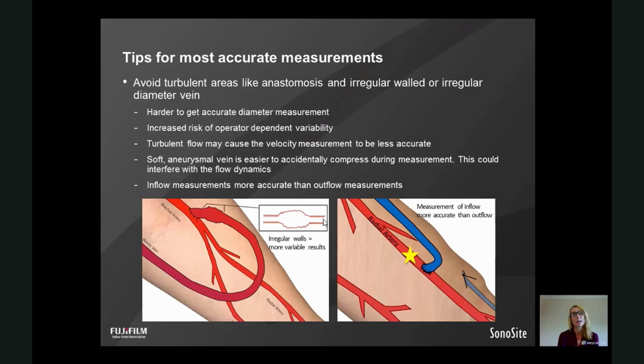But when we're talking about doing trends of volume flow measurements, where we're looking at a trend which maybe, for example, was 1,000 mils a minute 5 months ago and then it was 800 mils a minute, then it was 600 mils a minute, we know something's going on. So when I'm looking at trends, it's not particularly an issue, because whatever's running down the brachial artery, if it slows down, it's because the fistula is slowing down. It's not because the feed to the hand is slowing down.